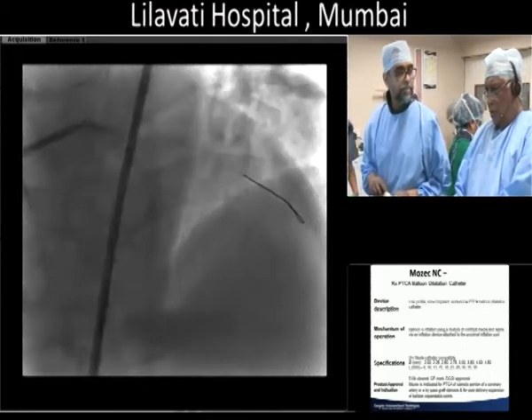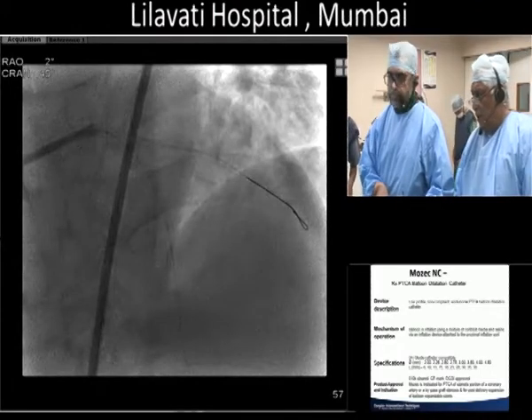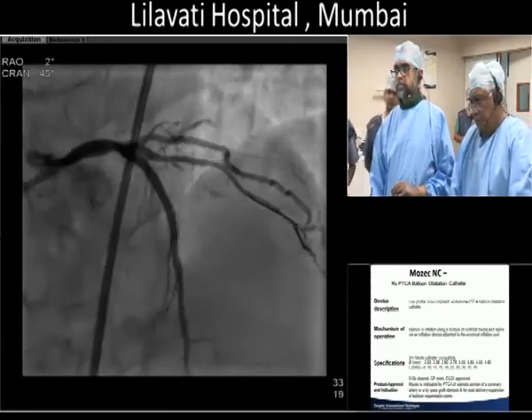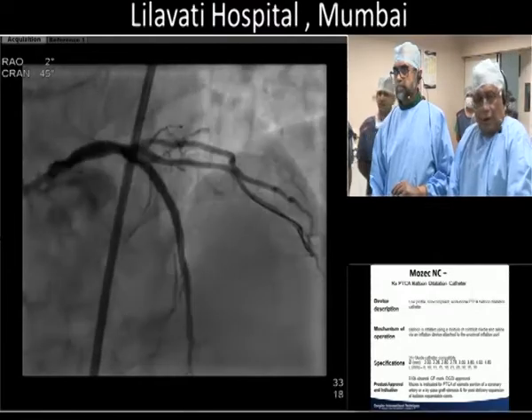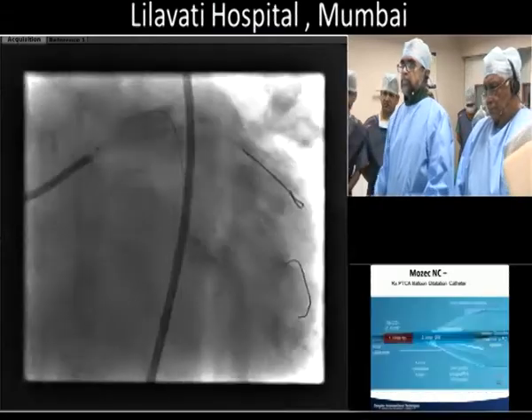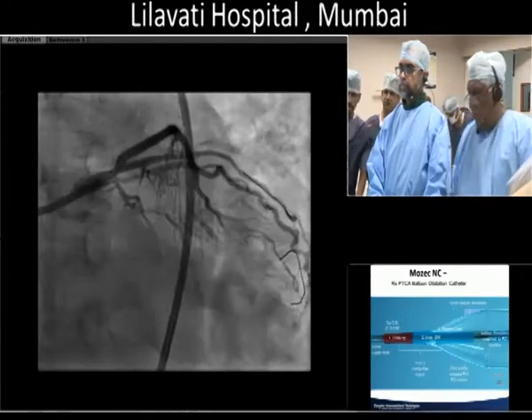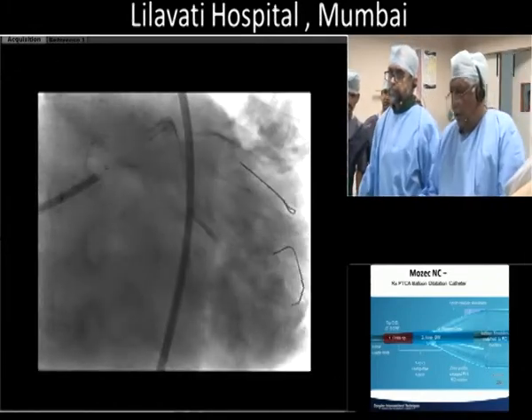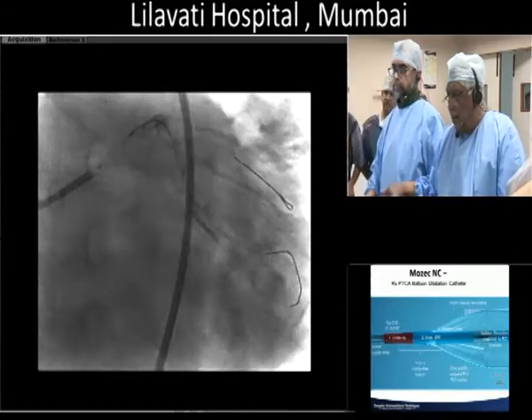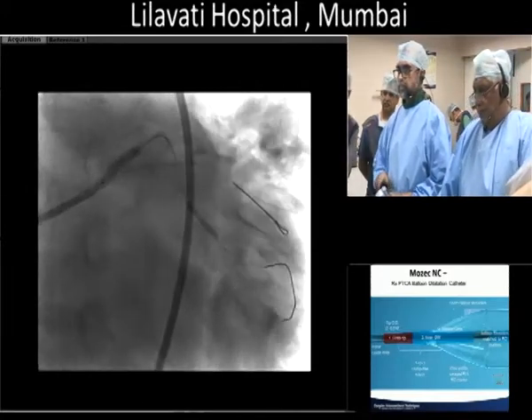Chest pain. Take a picture. Looking good. You see the importance of post-dilatation here with the ectatic segments. And go up there again. So I'll go up there again at the ostium. Yeah, that needs to be expanded. There you go. There was a waist.